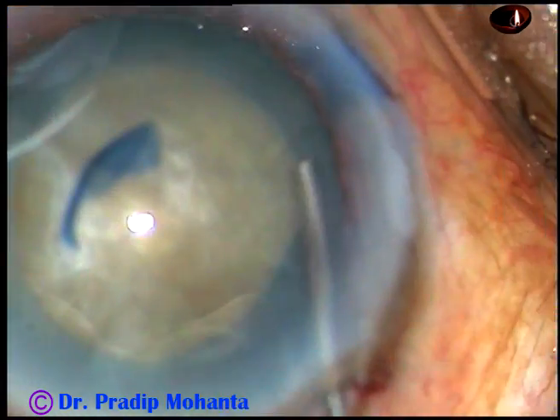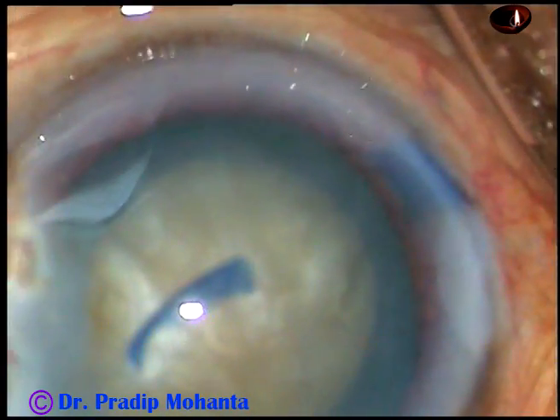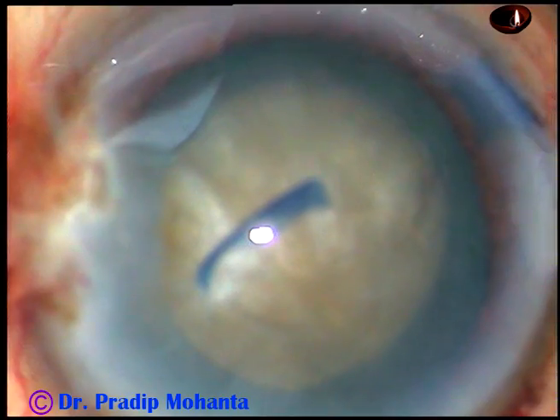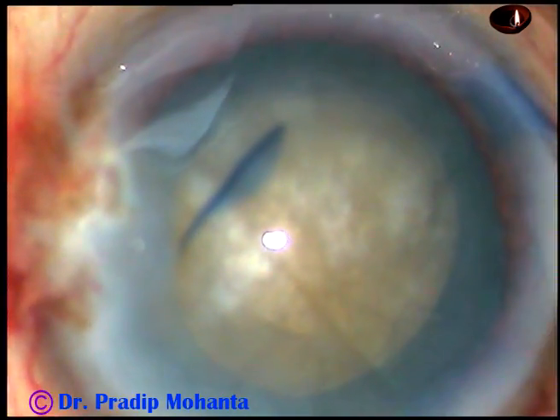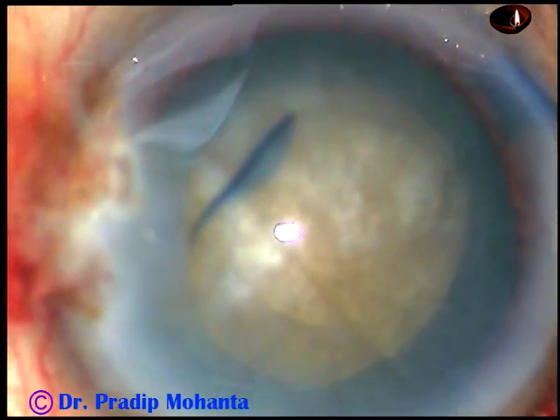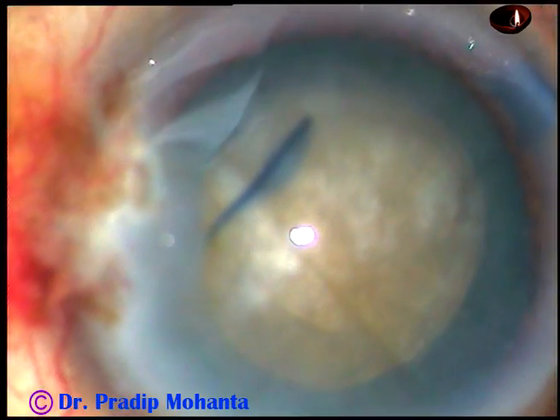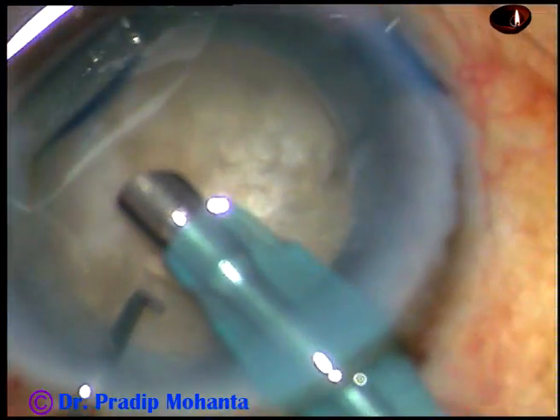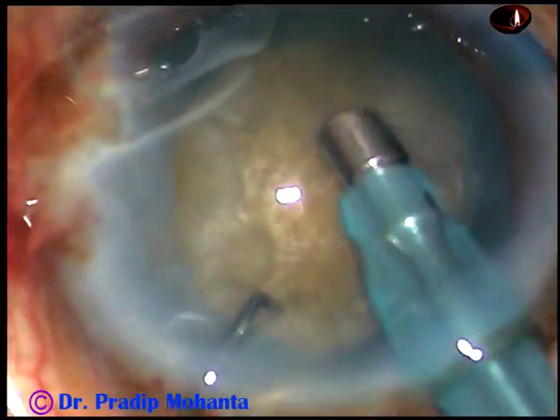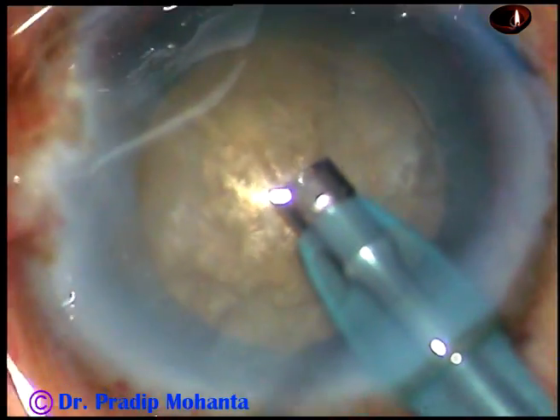This rhexis size is about 5 millimeters, and a little bit of hydrodissection is being done. Now let us see how the nucleus appears. The handpiece is introduced into the anterior chamber, some superficial cortical material is aspirated, and now we see a quite hard nucleus.